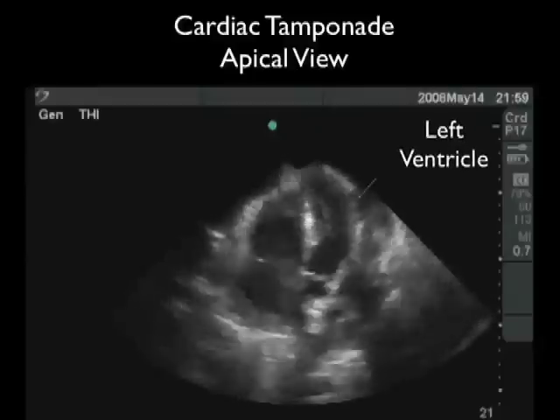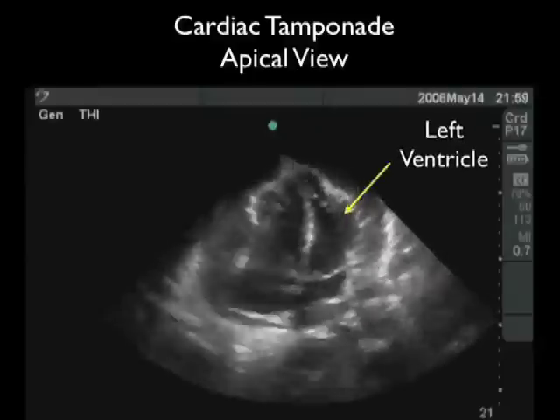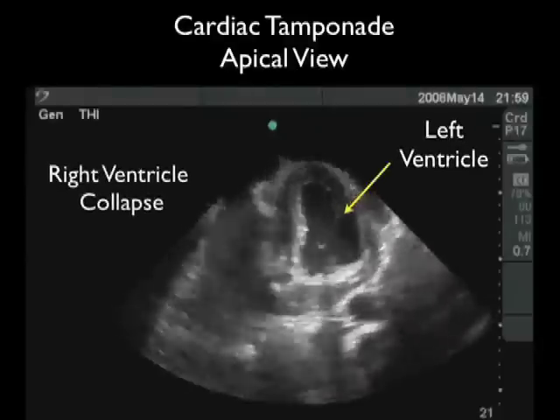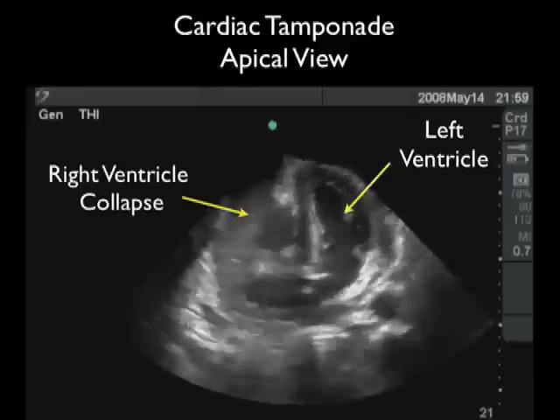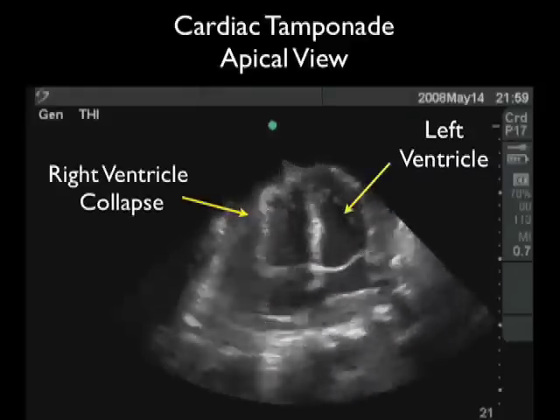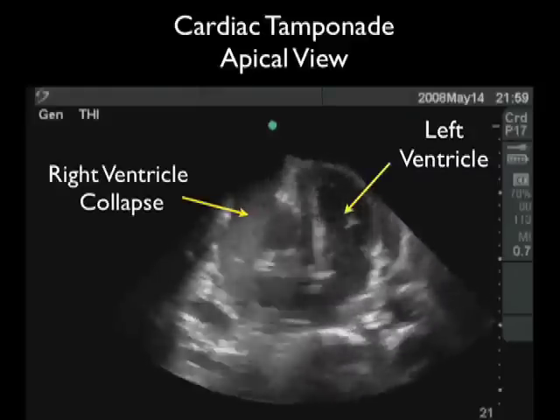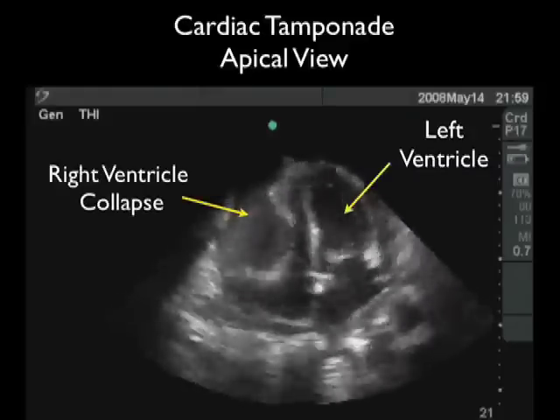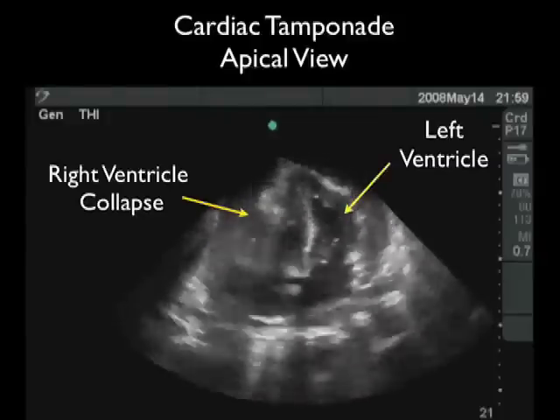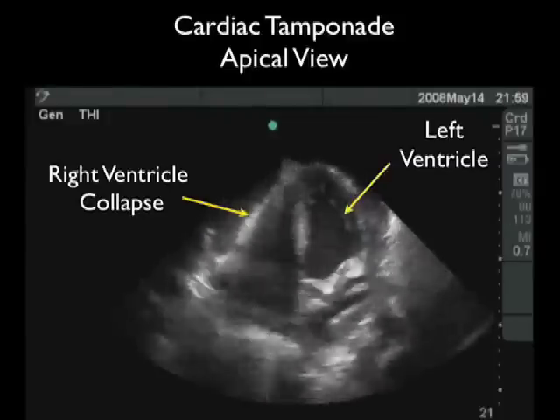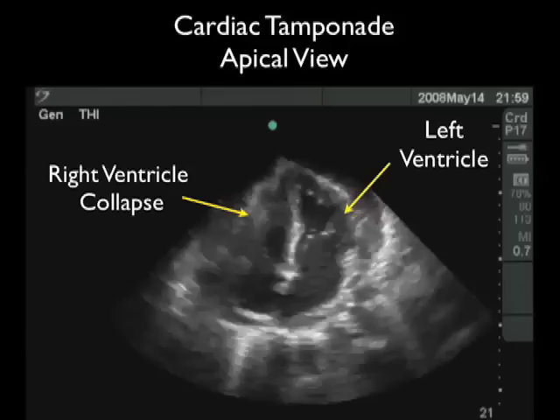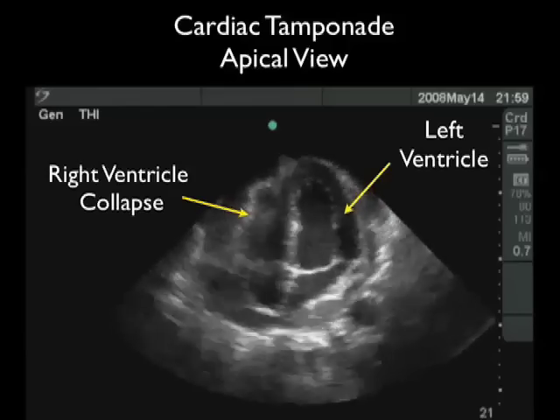Here's a patient who was in bad shape and presented with acute shortness of breath. We see a very large pericardial effusion, and let's look specifically at the right ventricle — notice that it caves in during diastole due to the high pressure in the pericardial sac. This is indicative of advanced cardiac tamponade. This patient will need a STAT pericardiocentesis procedure.